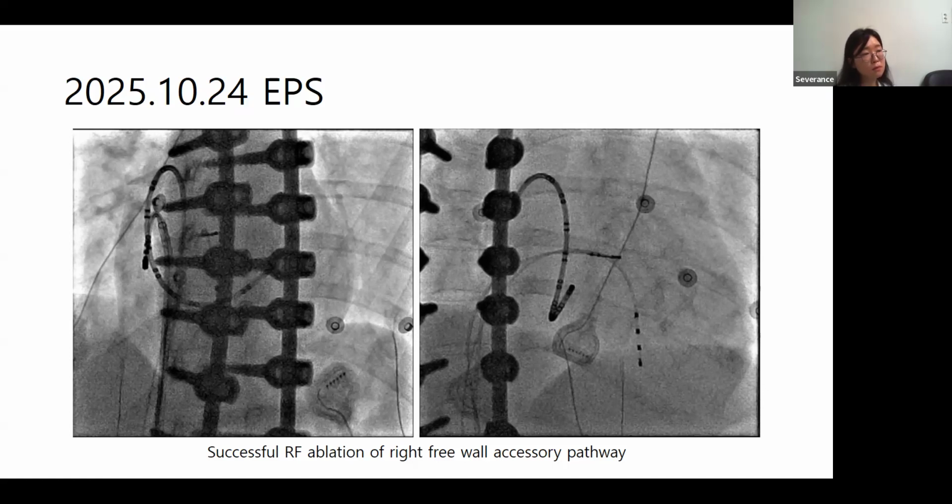high chance of recurrence, and it may also hit the AV node and His bundle, even though there is pulse. Think about that. Even though you use a catheter, if the catheter moves like this, it cannot make good contact. That's why I make a U-shaped curve, and the catheter slips along the crista terminalis. Then there is more contact to the endocardium, which stabilizes the catheter position better.